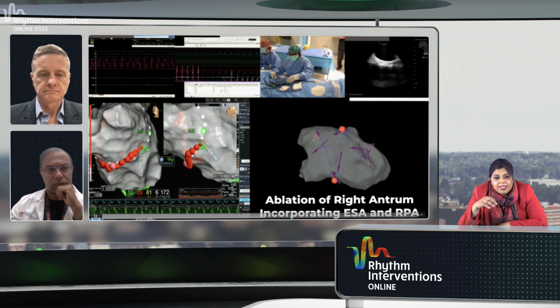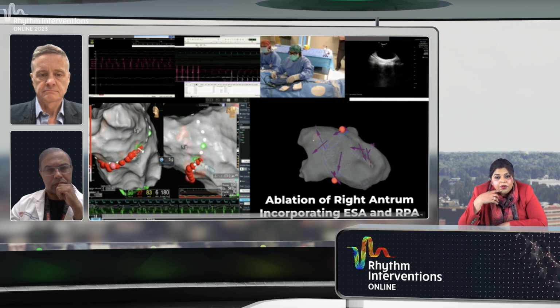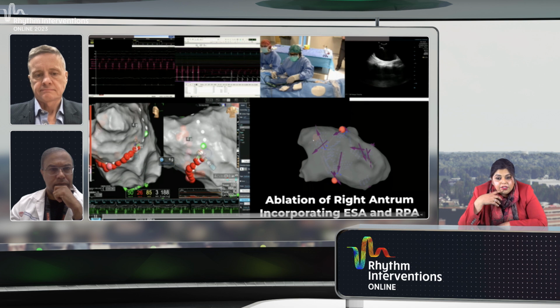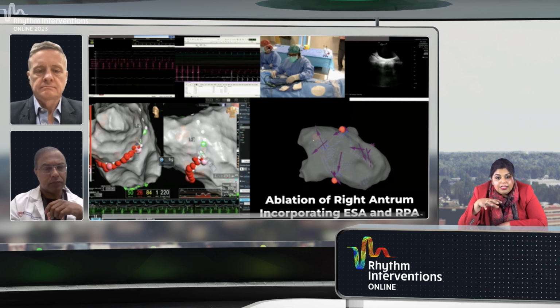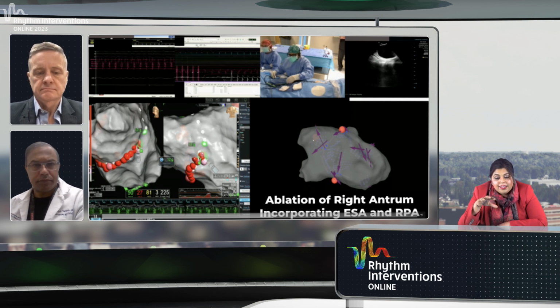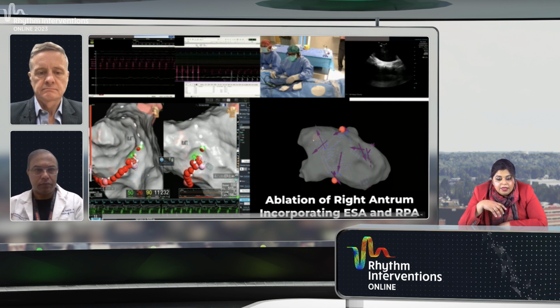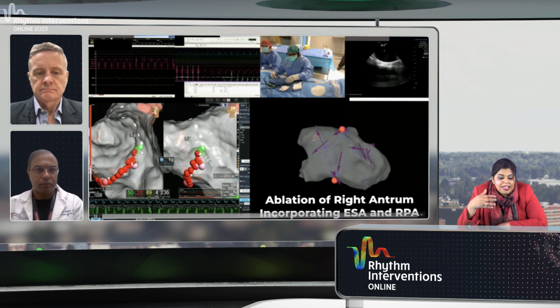And I want to take a moment as we get to that anterior septal area. This was one of the areas that we had identified that had a lot of early sites of activation, and also some really interesting paths, especially with the signals going into the pulmonary vein there. And so the question is, how wide do you come?